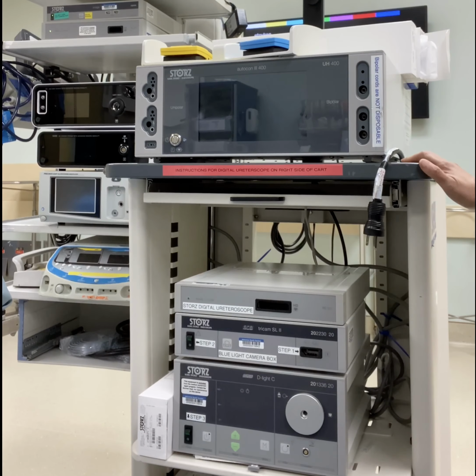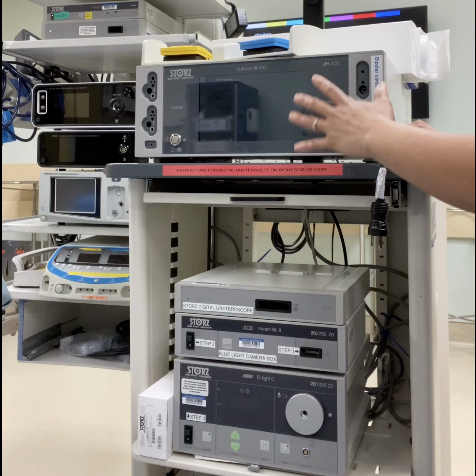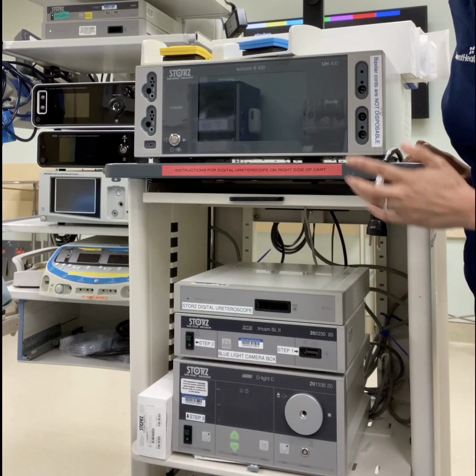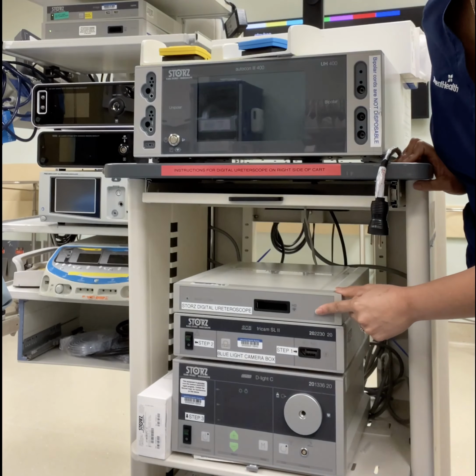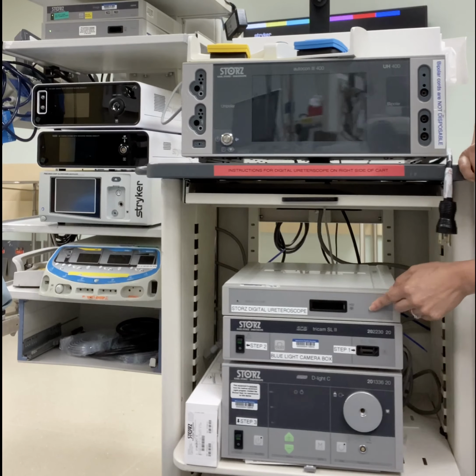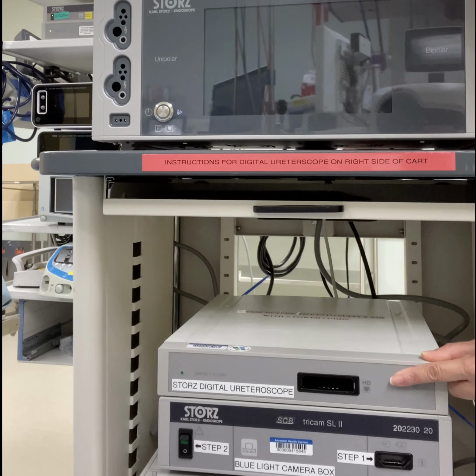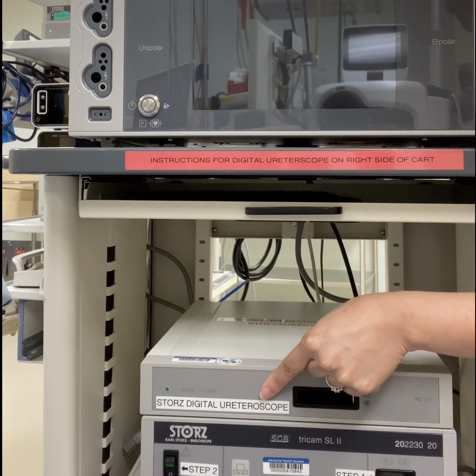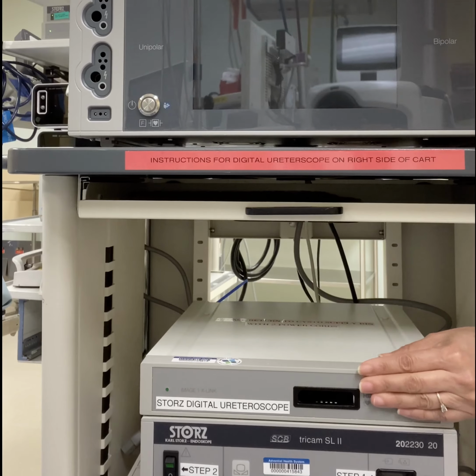Okay, so for the Storz Digital Ureteroscope, the three main things that you need to do a digital ureteroscope case, when the surgeon's asking for it, is number one, you need this blue light cart, because what lives on the blue light cart is the actual ureteroscope camera head box. That's the only box on this whole thing that you'll be using. As you can see, it says Storz Digital Ureteroscope. That's the camera box. This is the main piece out of the whole thing, okay?